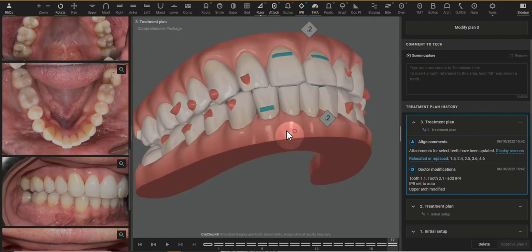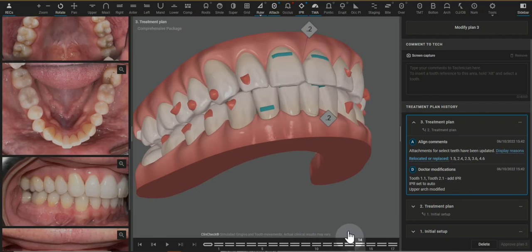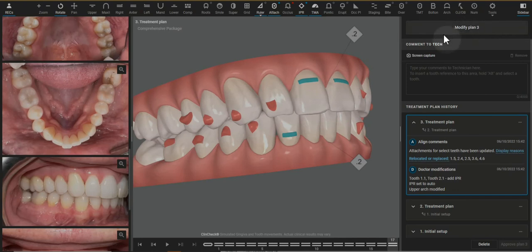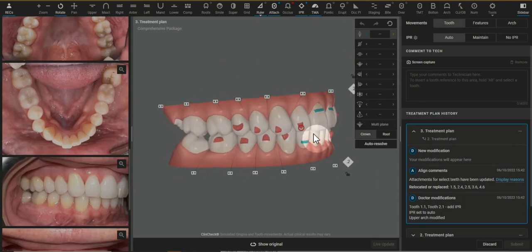This lateral — the crown is being tipped buccal, so that is all fine to do, but there's mesiodistal root torque planned in on this tooth as well. You can change this up with the 3D controls.